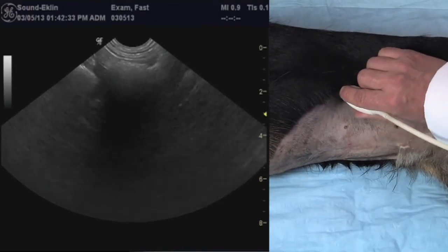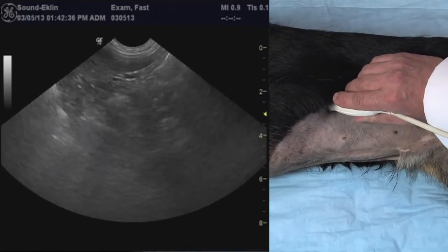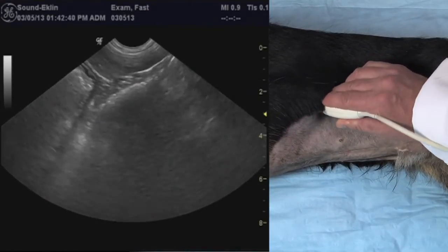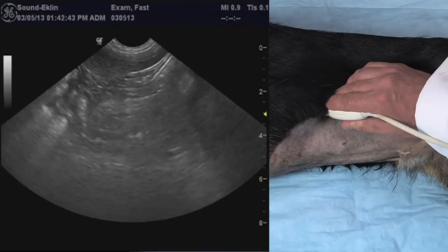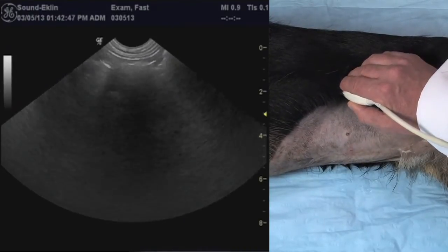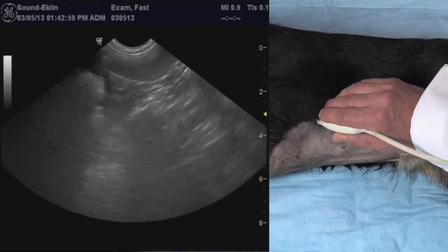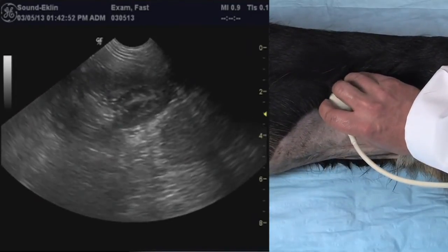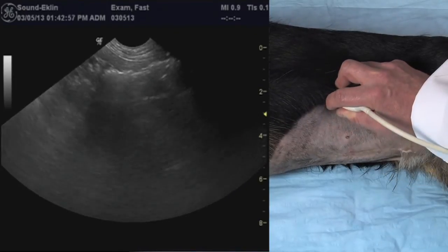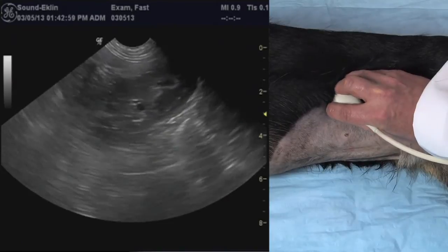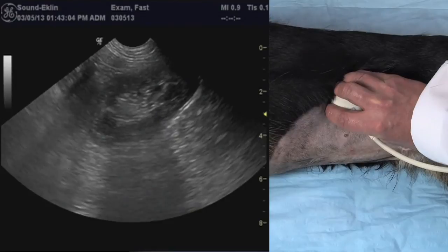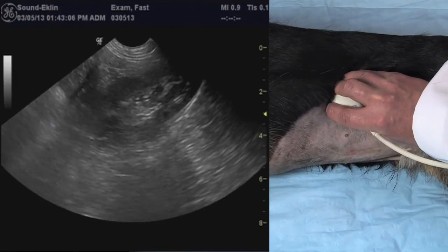In this view, once we achieve seeing the left kidney, we know that we have a window into the retroperitoneal space, as well as picking up the spleen in the foreground — confirming we are in the intra-abdominal space. The left kidney is in view and we can pan ventrally towards the tabletop, cranially and caudally, spotlighting this area for free fluid. This dog is negative for free fluid.